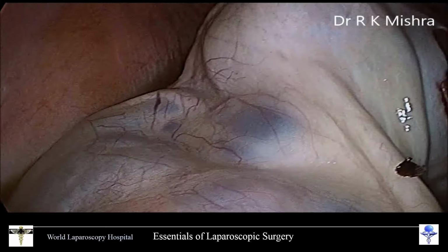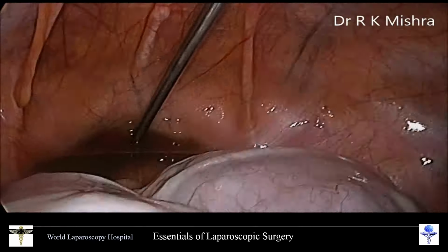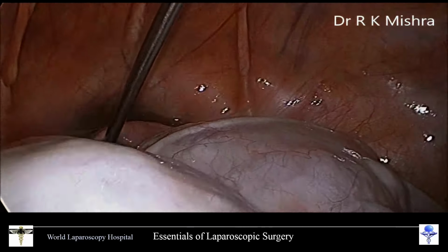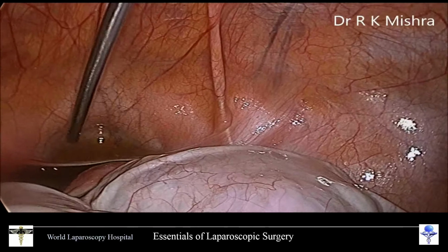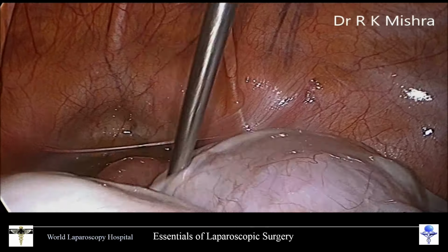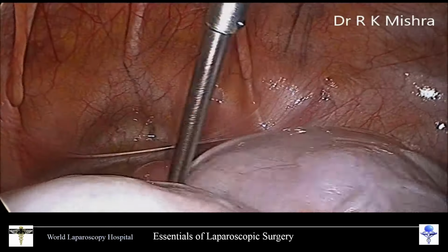Colpotomy has one more advantage: you do not have to put a drain, because it is itself a dependent area. This is the uterus. The uterus is a very small nulliparous uterus. This is the anterior cul-de-sac. Then you will suck from the posterior cul-de-sac. After that, oophorectomy will start.